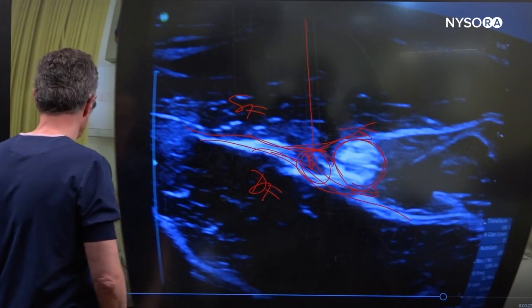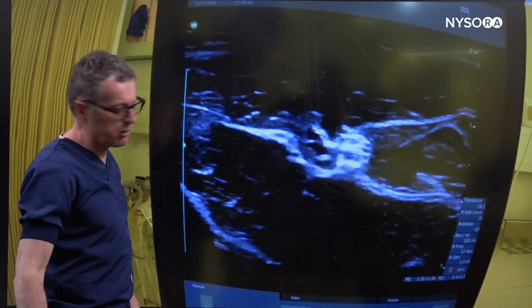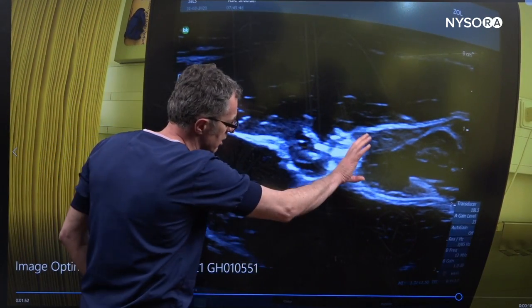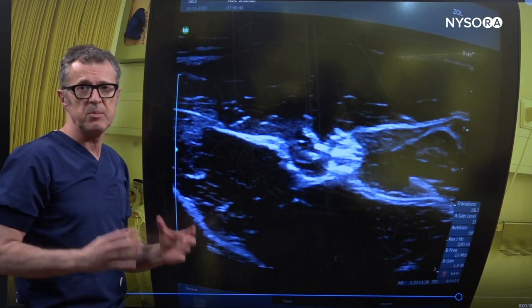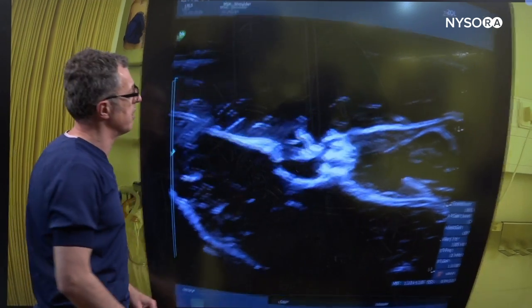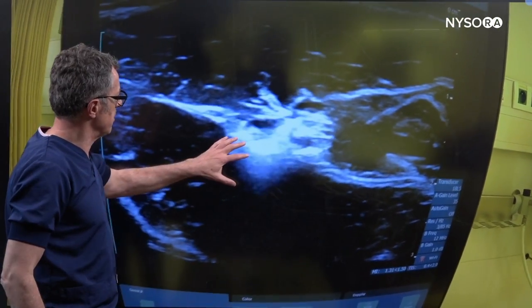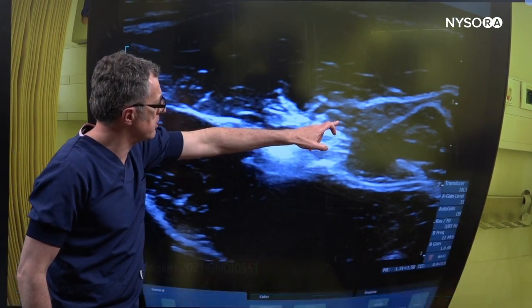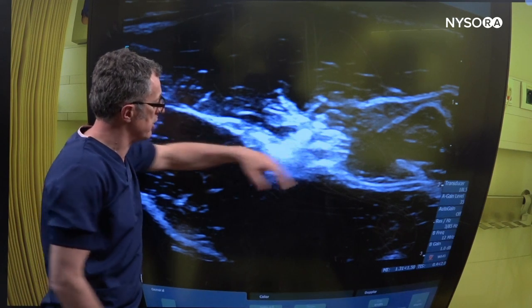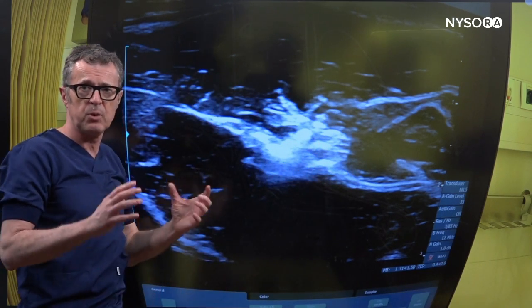Let's see the injection. As we start injecting, we can see how the local anesthetic pushes the nerve away and fills the fascia plane between the superficial and deep fascia of the flexors of the wrist. We can see a little bit of air being injected, and we can see how far the local anesthetic reaches away from the injection site, confirming that we are injecting into the plane where the nerve resides.